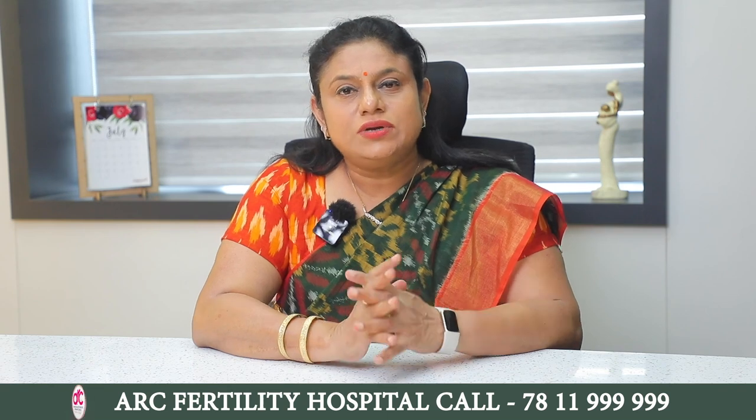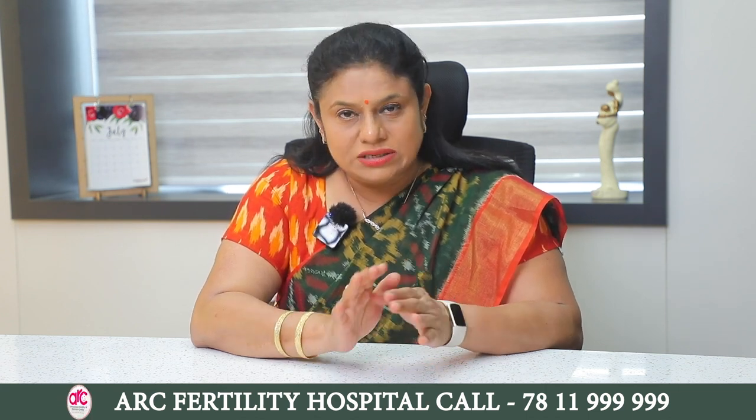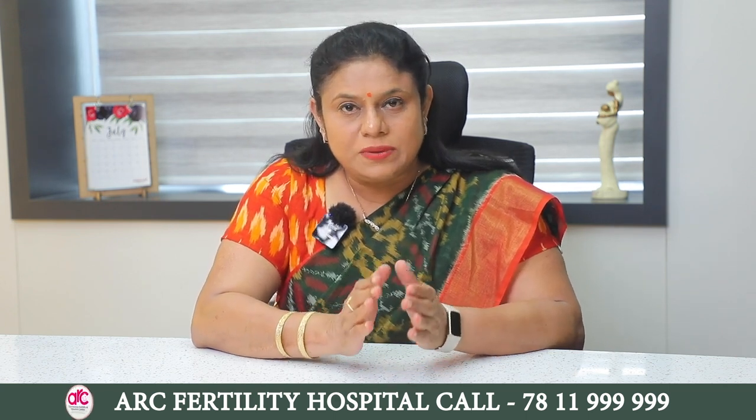Hello viewers, today I am here to tell you whether a hysteroscopic evaluation of the uterine cavity is essential prior to an embryo transfer. We have to understand that the uterine cavity is the place where the embryos are going to be placed, nurtured, implanted and grow. So it is very essential for us to do a basic uterine cavity evaluation prior to an embryo transfer.